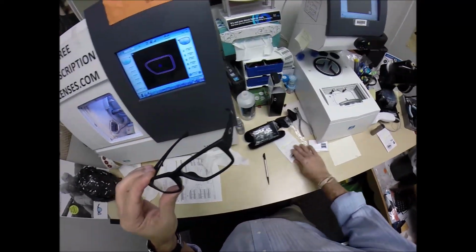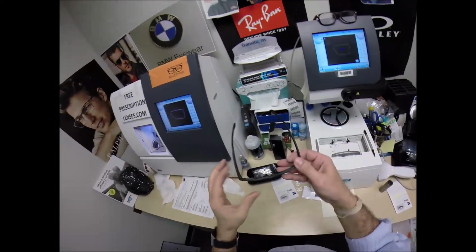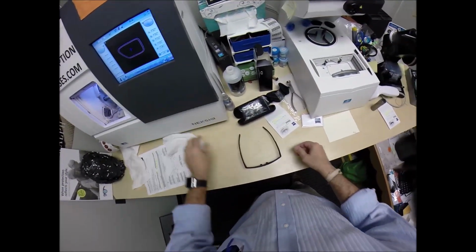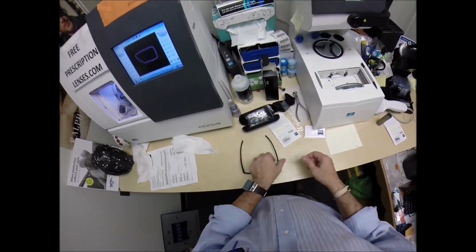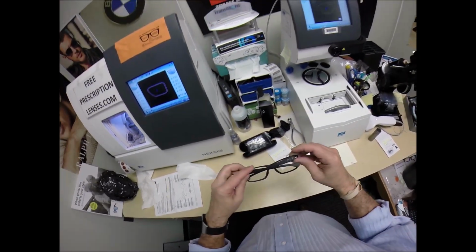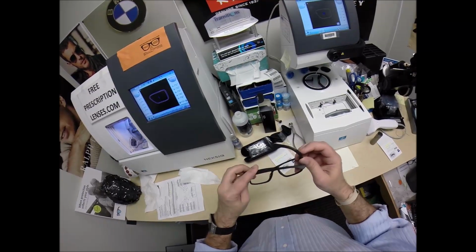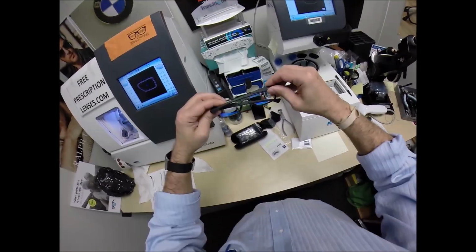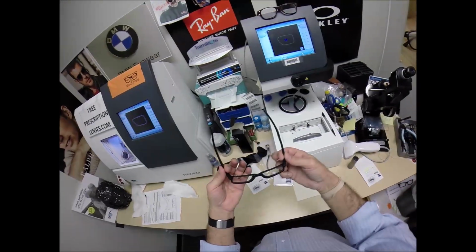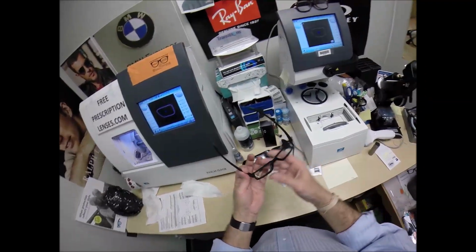But I'm going to get these in standard alignment first, also known as a 3-point stance. The 3 points are 1, 2, and the bottom of the frame being 3. I set them down and press down. There is no wobble. Flip this over, press down. There is no wobble. Close each temple to make sure they overlap perfectly, that neither temple is askew like that. Check the tension on each hinge. If one was tighter or looser, I would loosen or tighten accordingly.